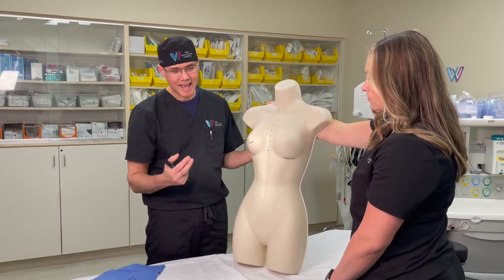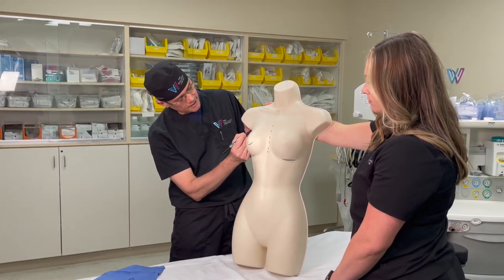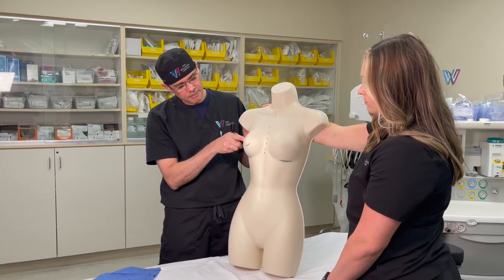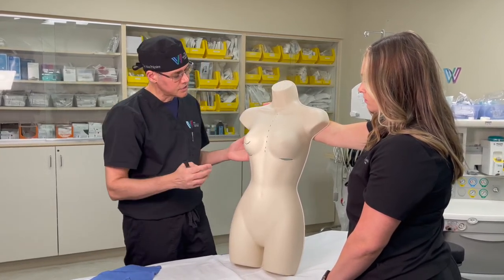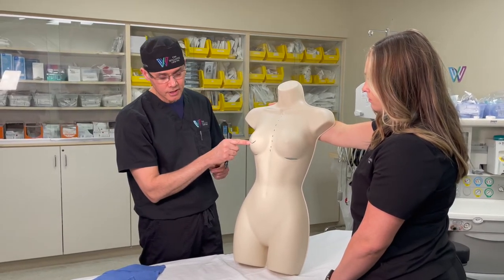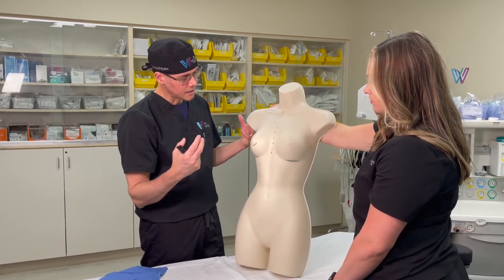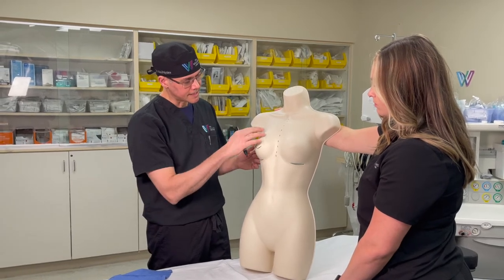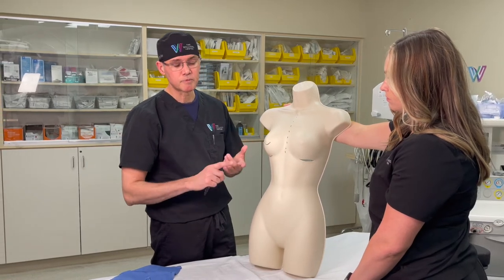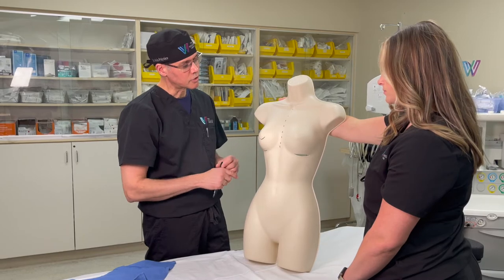The other incision can be an inferior areola approach — placing an incision just under the areola. This is a good technique that hides a scar very nicely just under the areola, and those scars are almost imperceptible, barely visible by three to six months. Finally, we have the axillary approach, placing a small scar in the armpit right at the top. Through there you can do a dissection, get under the muscle, and place the implant that way. All three approaches — axillary, inferior areola, or inframammary in the fold — are great and allow us to place the implants under the muscle. The choice depends on patient preference or anatomy.